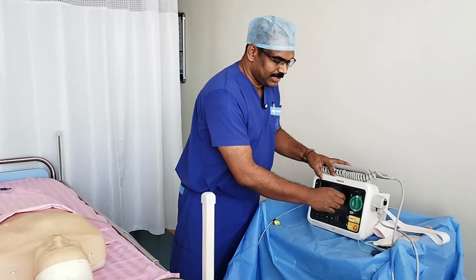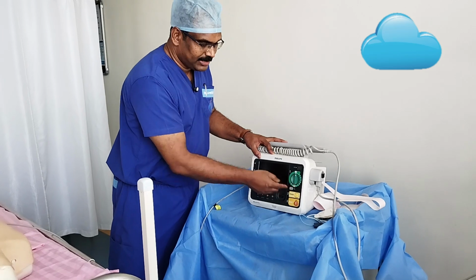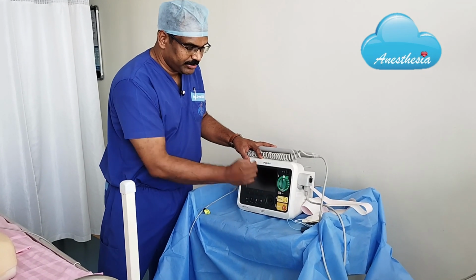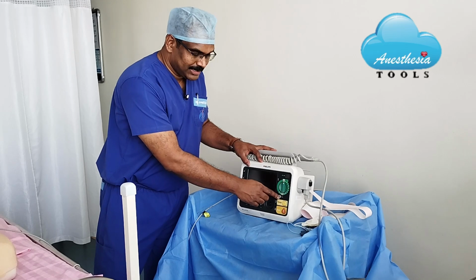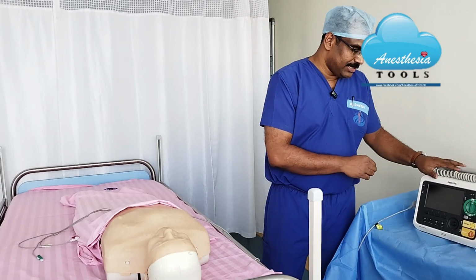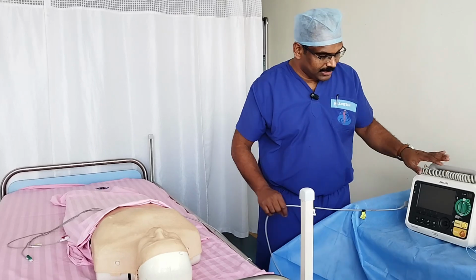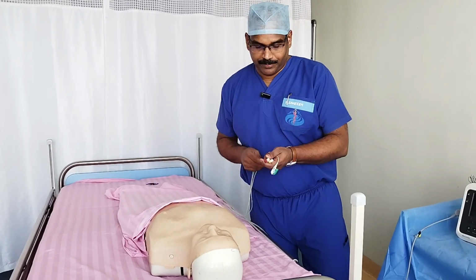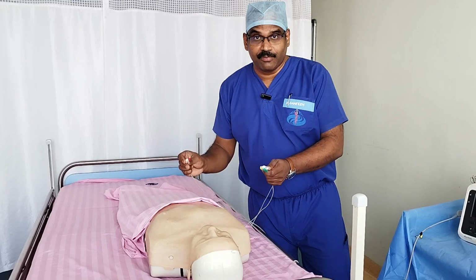Again, you come to this machine, you select the energy required, say for atrial fibrillation, you select something between 100 to 120 and then press sync. Make sure that the ECG electrode should be displayed on the device, and you need to attach the ECG leads of the defibrillator.